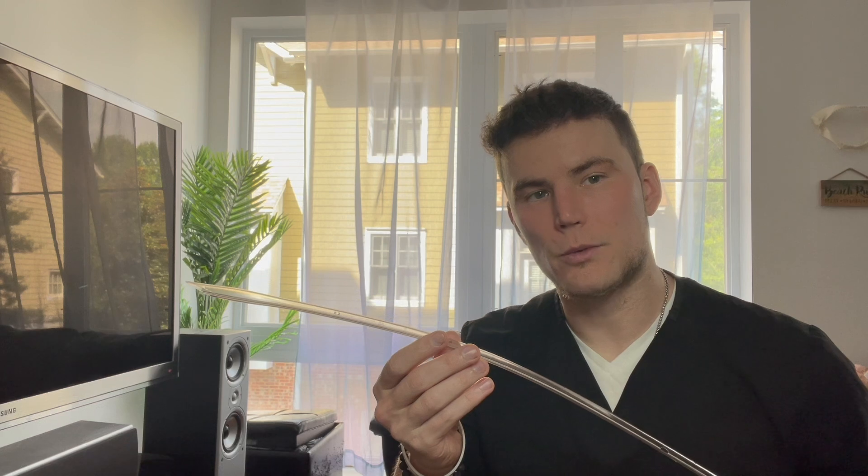Okay, in this video I'm going to show you how to secure two different types of chest tubes: a pigtail catheter and a large bore chest tube, this is a 24 French. I haven't seen too many videos that show you how to do both in the same, so hopefully this will be a good resource for you.